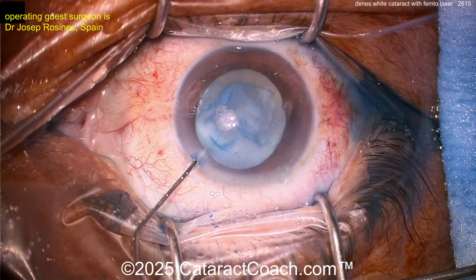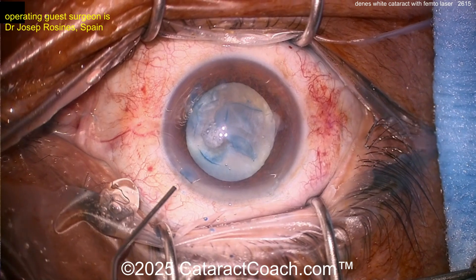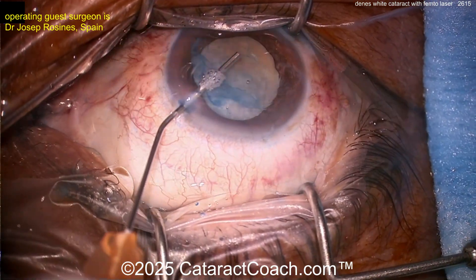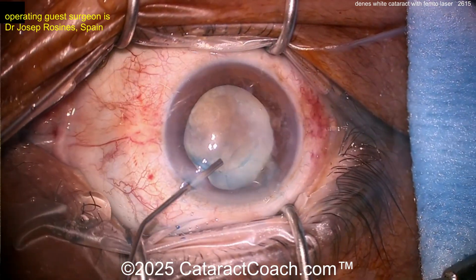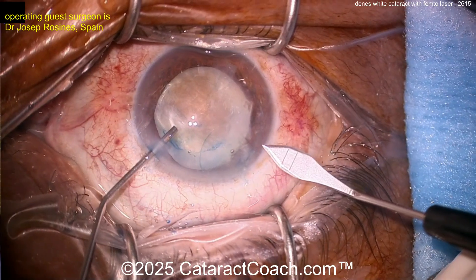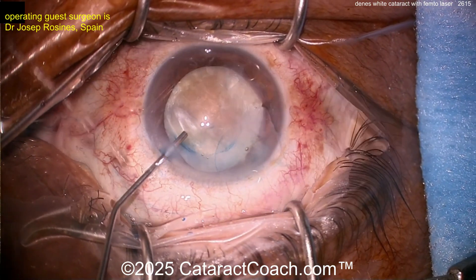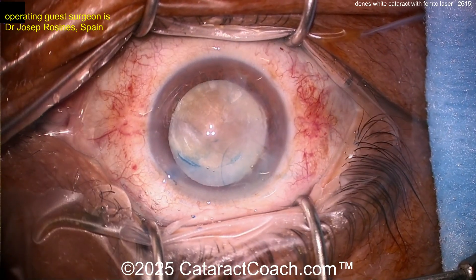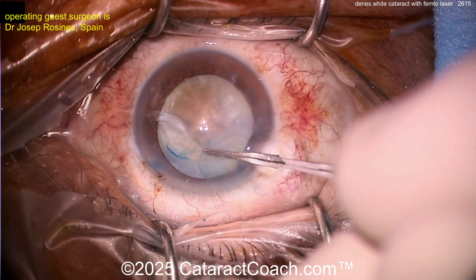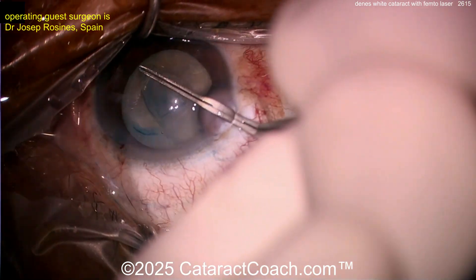Let's see — is the flap completely free-floating or is it still attached? There's trypan blue dye here and it looks reasonable. Let's put some viscoelastic in. It could still be attached. You ideally want a free-floating capsulotomy. Let's make a main incision and go inside to check — is it a free-floating capsulotomy? If so, you're in business; if not, carefully cut it or finish tearing it.